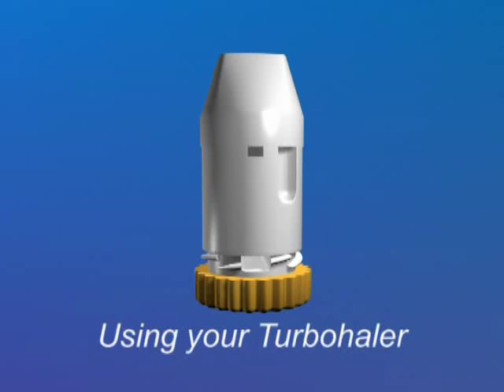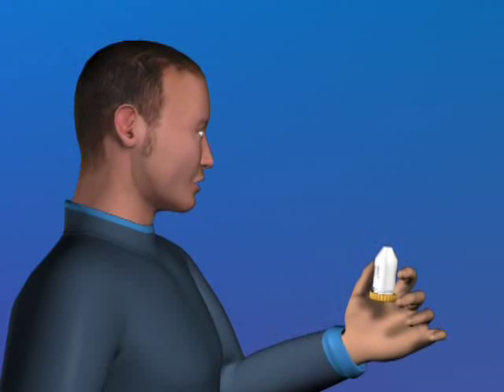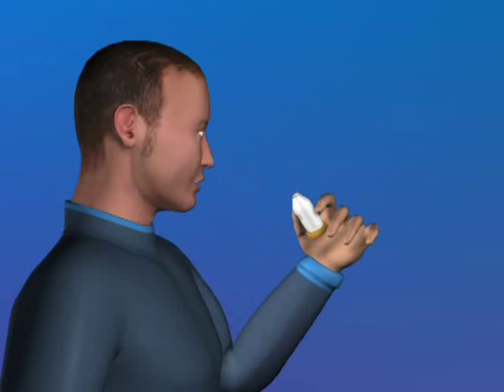Keep it away from your mouth at this point. To use your turbohaler, breathe out gently. Now place the mouthpiece between your lips and breathe in through your mouth as deeply and as hard as you can. Take the turbohaler out of your mouth and breathe out slowly.